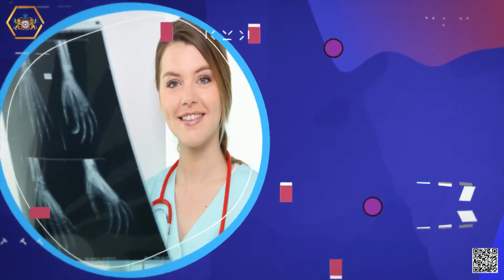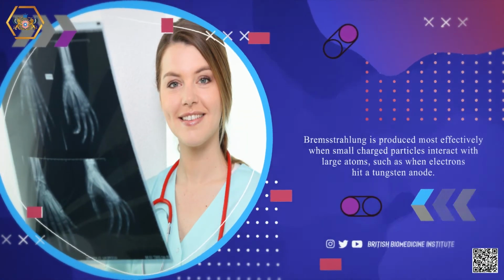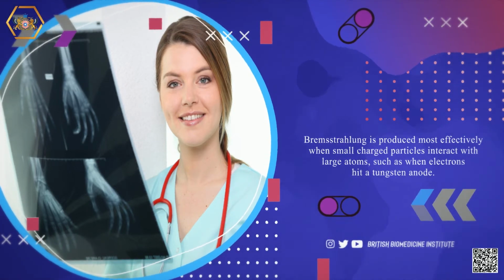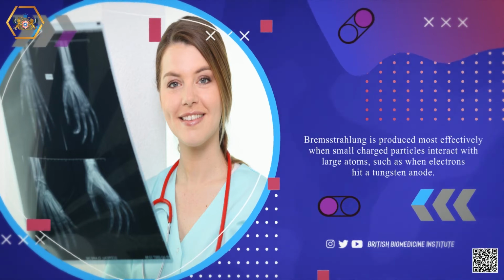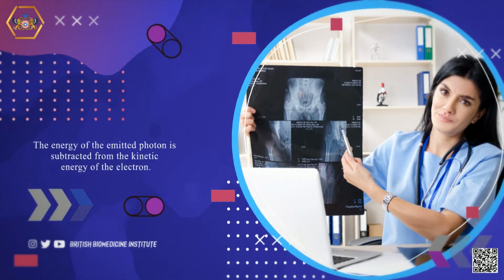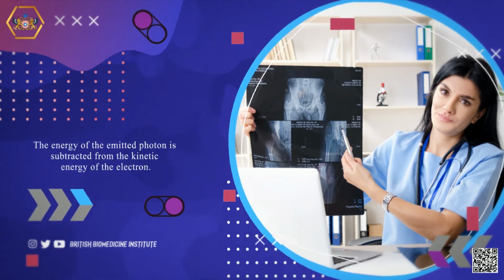Bremsstrahlung is produced most effectively when small charged particles interact with large atoms, such as when electrons hit a tungsten anode. The energy of the emitted photon is subtracted from the kinetic energy of the electron.